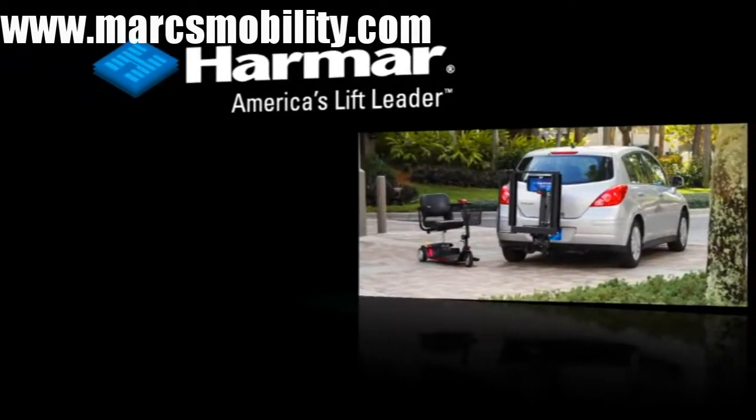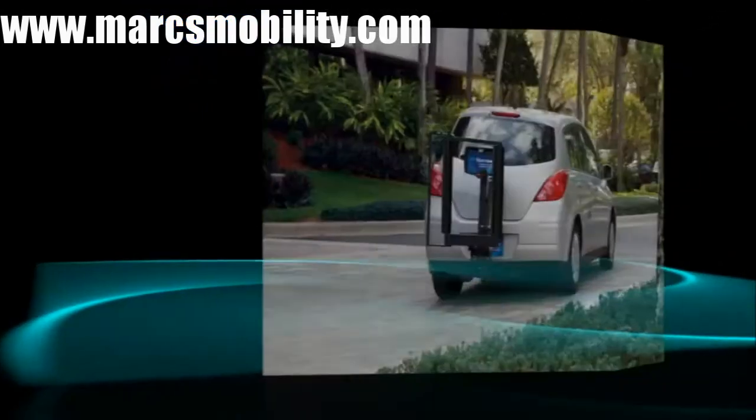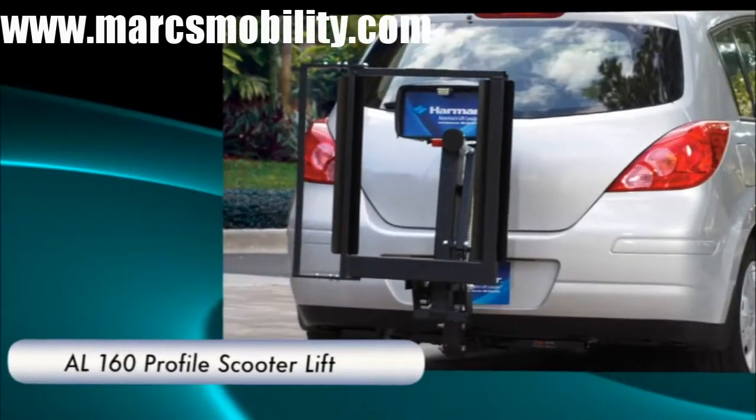Now you can transport your power scooter without giving up a small, fuel-efficient car. It's a breeze with Harmar's AL-160 Profile Scooter Lift. The simple, streamlined design has the strength to carry your scooter safely.